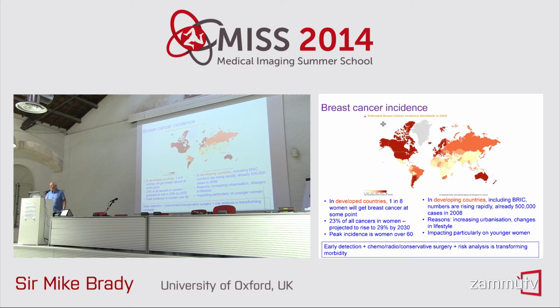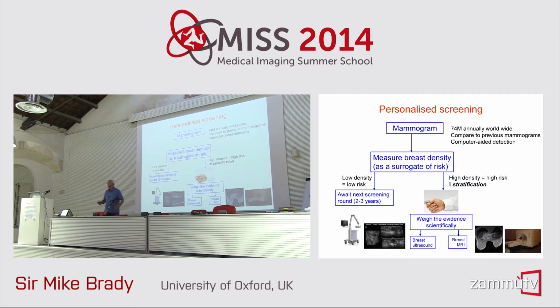So the movement nowadays is towards what is known as personalized screening, and indeed I have a major European grant with Nico Kassemeyer from Nijmegen on this. So mostly what happens is women have a mammogram, and I'll explain why in a second, as the first port of call. There are currently around 74, 75 million mammograms taken per year. They have to be compared to previous mammograms because of the huge variation from woman to woman.